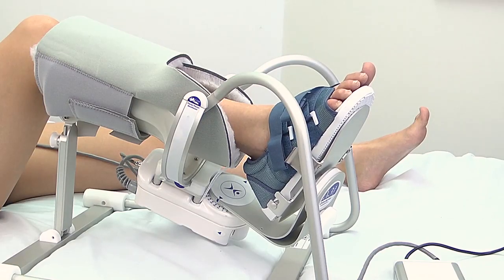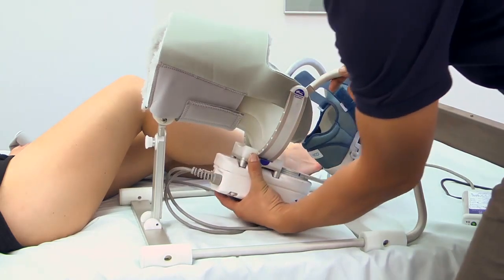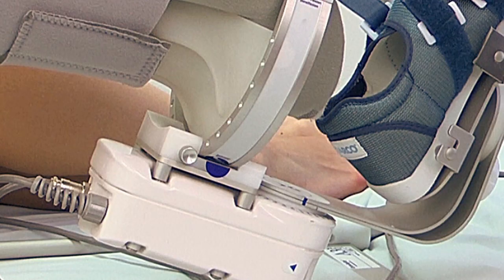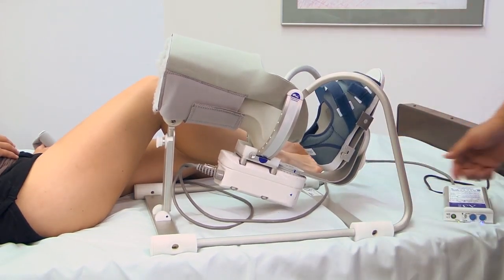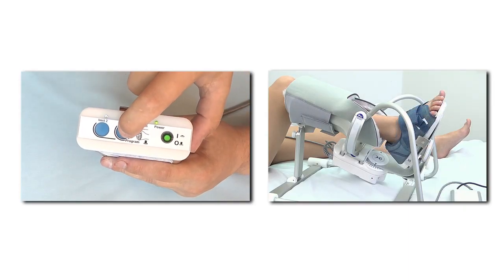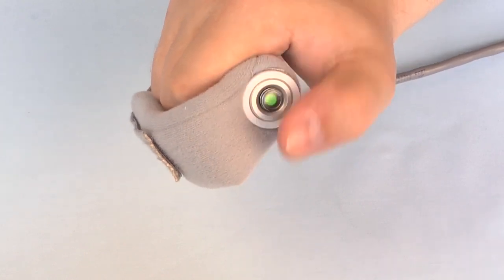To set up programming for inversion eversion, press and hold the actuator button while rotating the actuator to the bottom of the actuator ring. The two halves of the blue dot should meet underneath the footplate. Next, loosen the footplate locking button and swivel the footplate until the shoe is upright again. Follow the previous procedure for setting range of motion limits and begin treatment by pressing the patient on-off button.